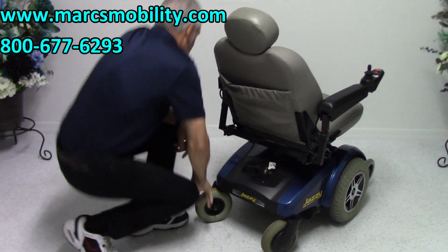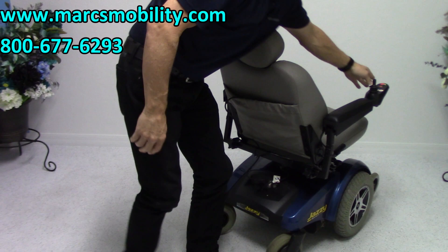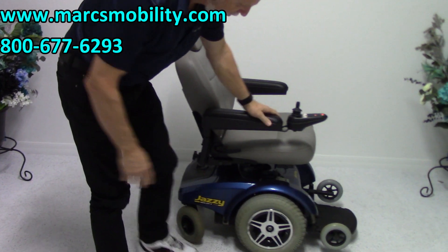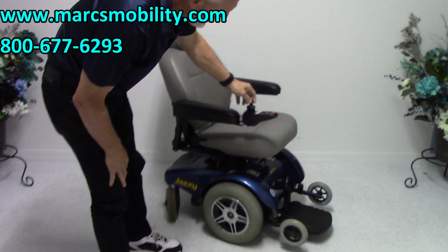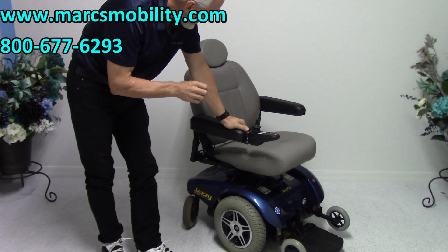You've got 8-inch caster wheels in the back and 14-inch drive wheels. These are solid wheels, so no flats.